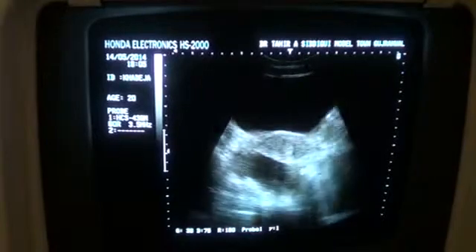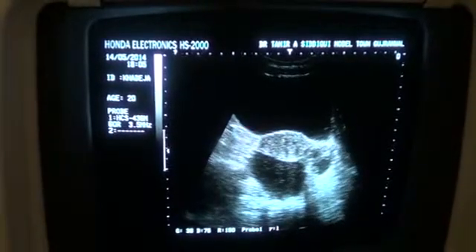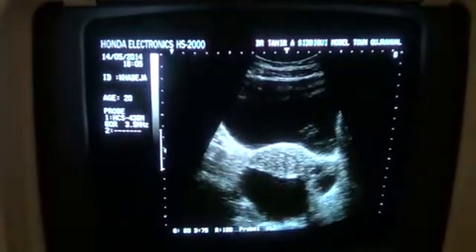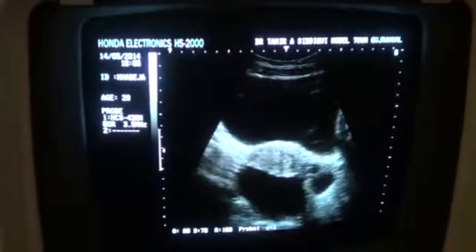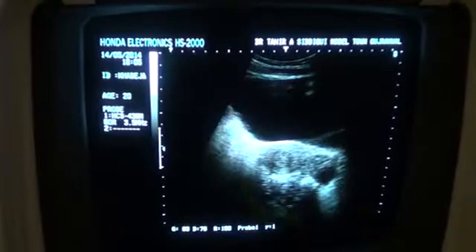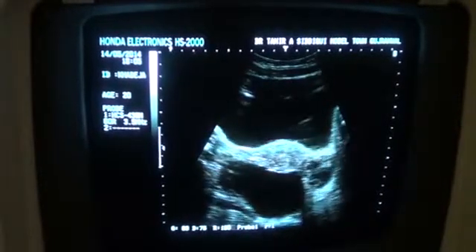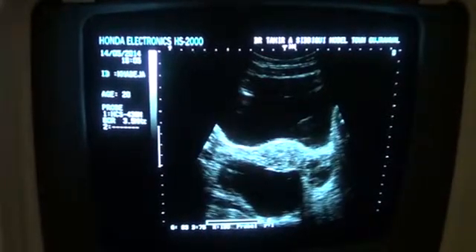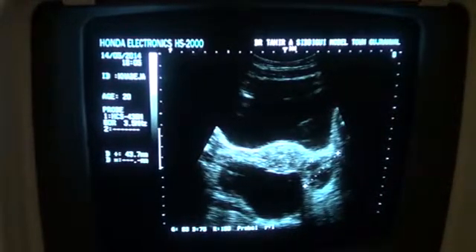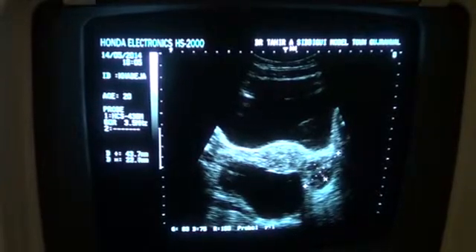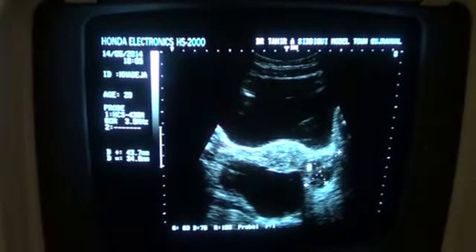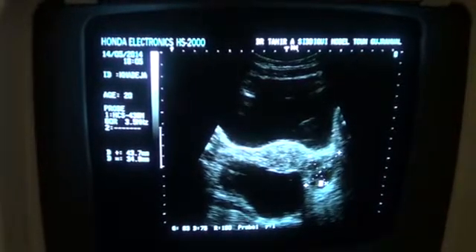In this view, we can see the ovary. I am going to reduce the gain to show you the left ovary. This is the left ovary with developing follicles seen in it. This is the ovary and these areas are the follicle ground. The cystic areas are the follicles.